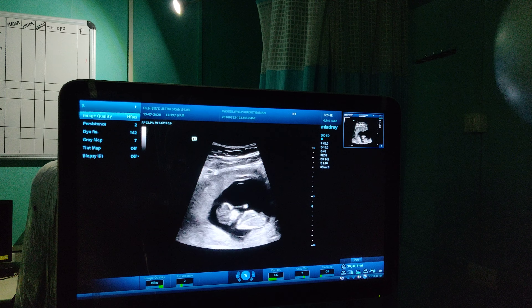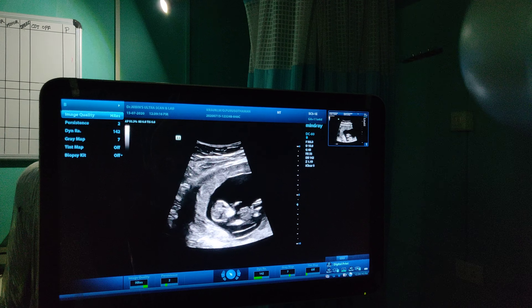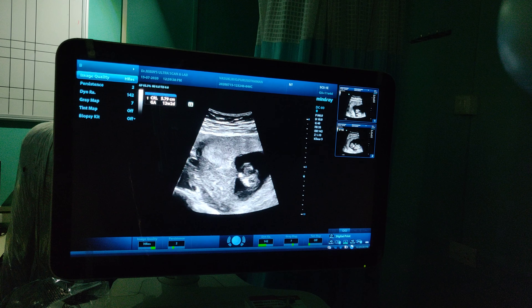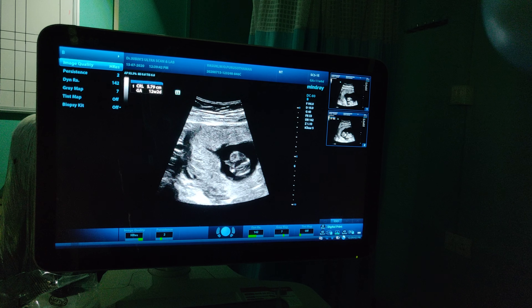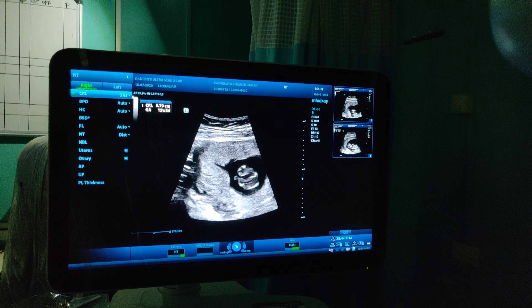So you can see the head, this is the thorax, you can see the cardiac activity, come down to the leg and see the foot. The whole parts of the body including the upper length has been done. Once you have done that, then you can take the crown rump length, that is head to toe length. The crown rump length is 5.7 cm at 12 weeks and 2 days.